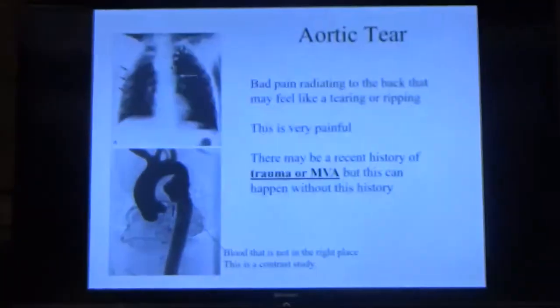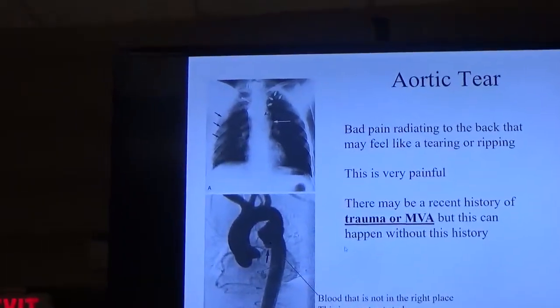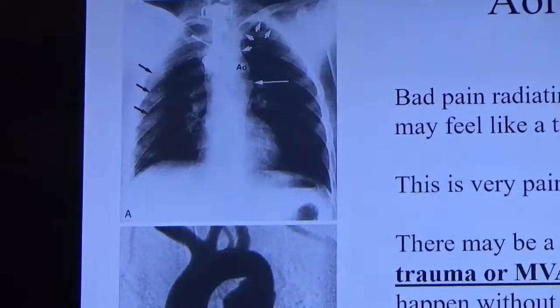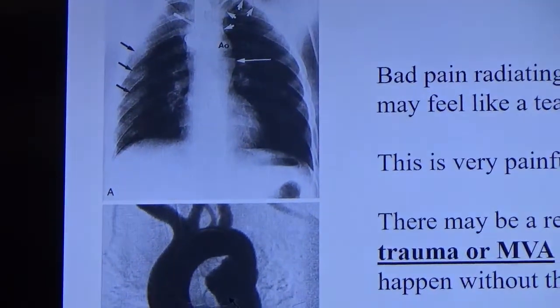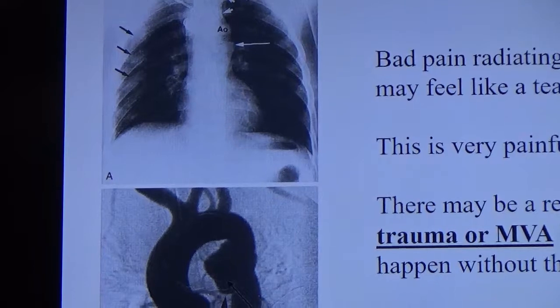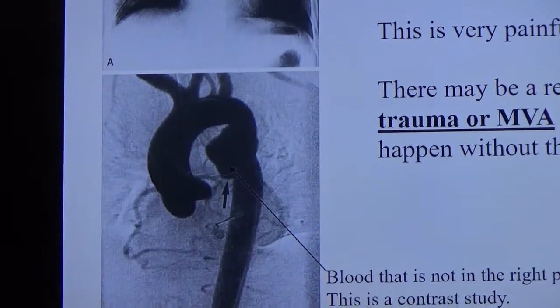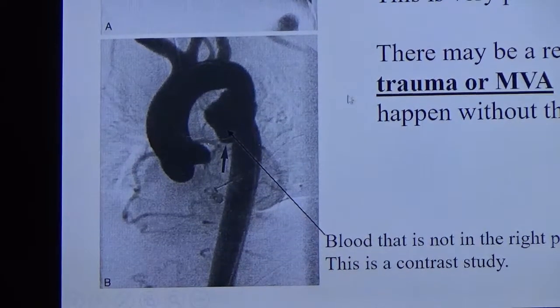This is angiography, which is the way that you diagnose. Well, typically today, you get a CT done with contrast, and it shows it, and they go straight to surgery, because these people will die on the CT exam bed.